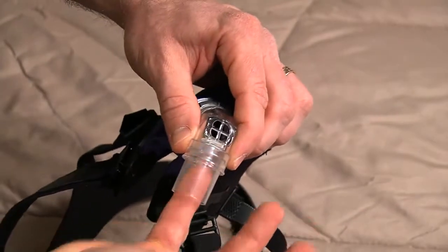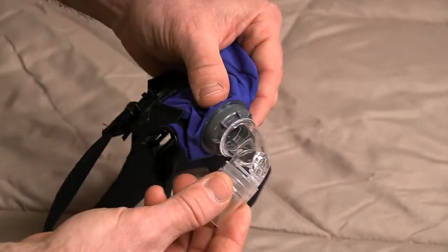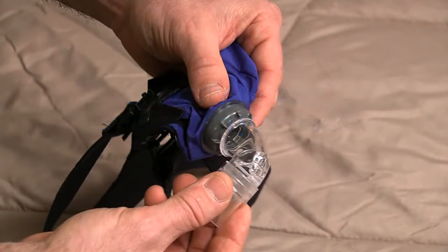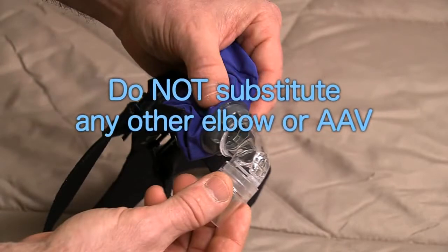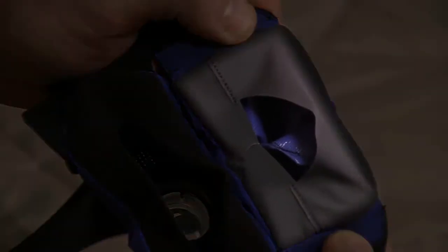Note: the 90-degree elbow with AAV is a safety feature of the SleepWeaver Anew. Use only the AAV supplied with your mask. Do not substitute any other elbow or AAV. The nasal interface of the mask covers the nose with soft, comfortable cloth.